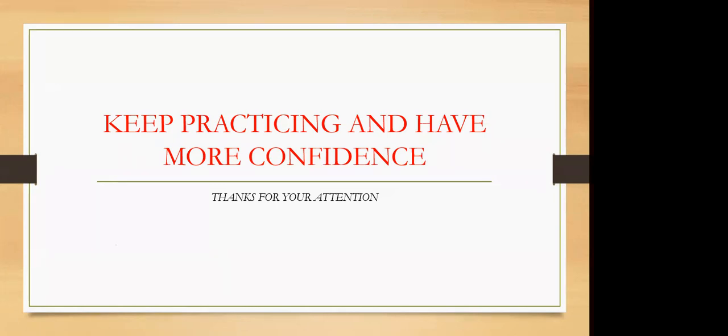The second point we can also use to increase the sensitivity is this: if they tell you, for example, that the pain is in the right iliac fossa and it's all over, try using the graded compression technique. Keep pressing as you're looking at this patient, as you're looking at your screen. Whenever you press and you see that the patient reacts to the pain, then most likely that is where the appendix is. Because the pathology of the appendix is usually to cause pain in one place. So if you keep pressing in that iliac fossa and the person does not react, does not give any facial expression of pain, then you know here we are safe.